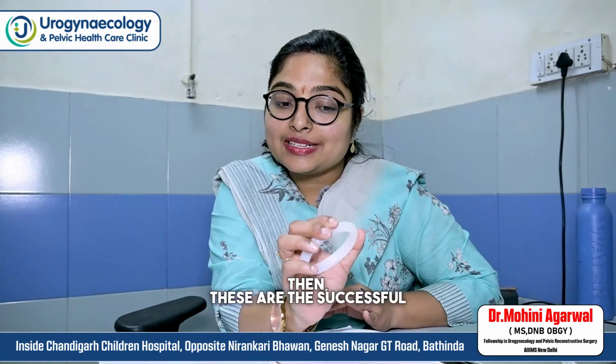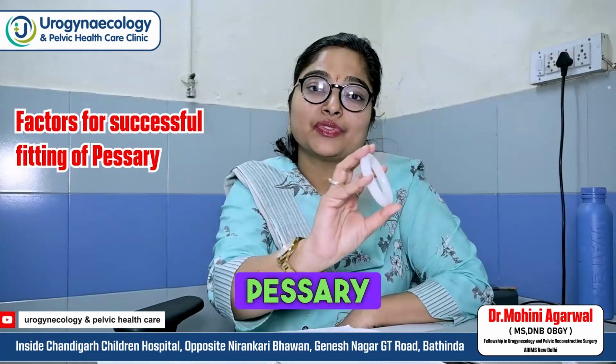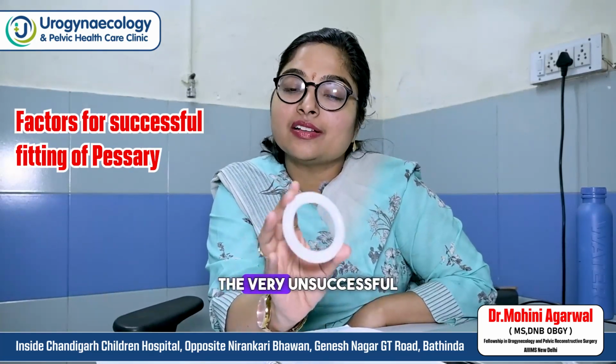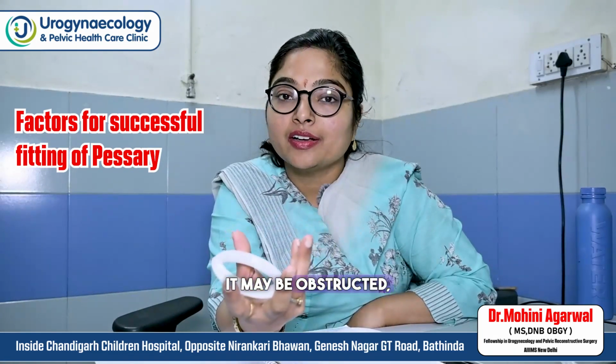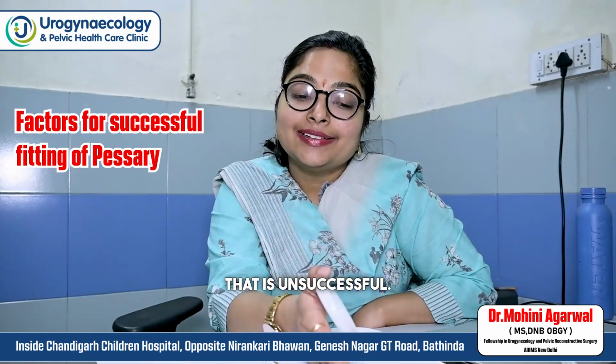There are high chances, about 85%, that successful fitting of the pessary is achieved. Now, unsuccessful fitting. The first cause of unsuccessful fitting is size. If the size is not right, the pessary may fall out, or it may be obstructive and the patient may not void after you have inserted the pessary. That is unsuccessful.